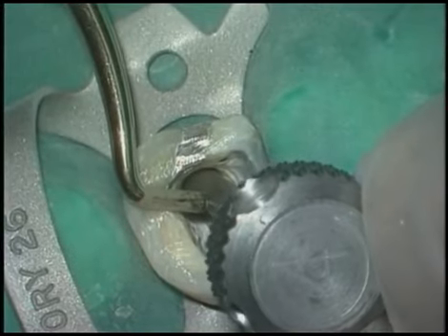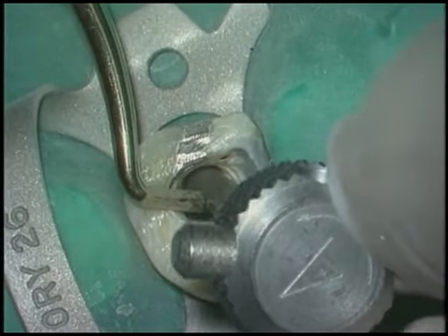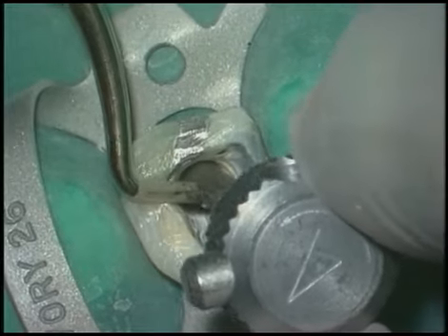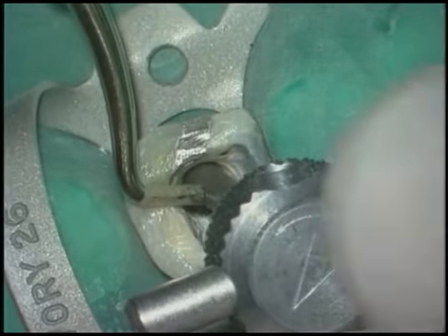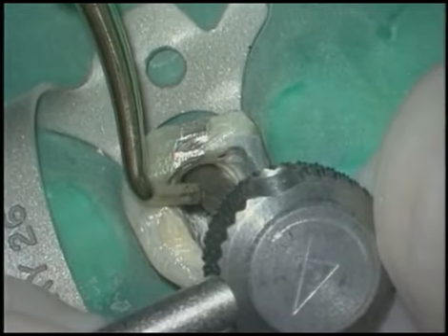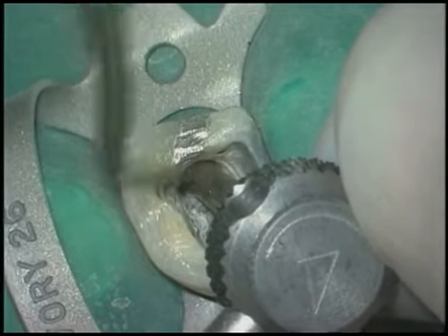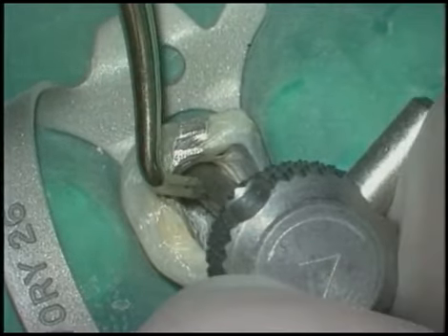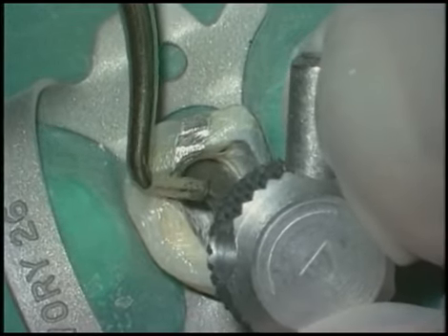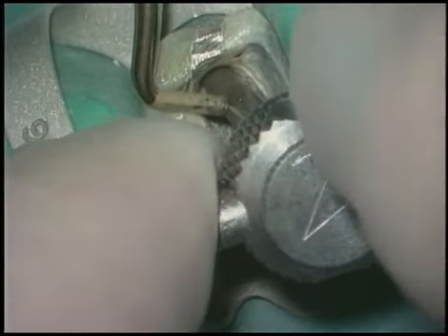Having just broken the post, we're going to now use ultrasonics in conjunction with the torque bar. The ultrasonics will transfer energy through the tubular tap into the post, and that will facilitate cement bond failure. Slowly and progressively turn the handle. Flexi screw posts can be a difficult post to remove, and so having just had a breakdown, we're going to spend a little bit more time here to ensure successful removal.